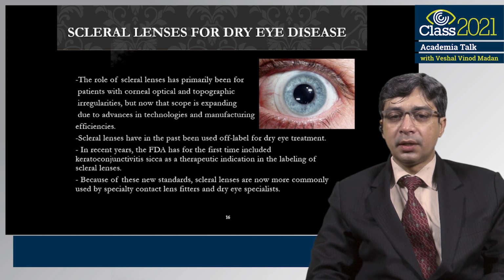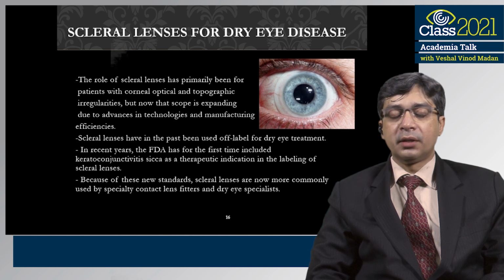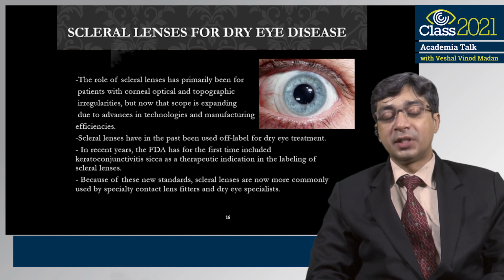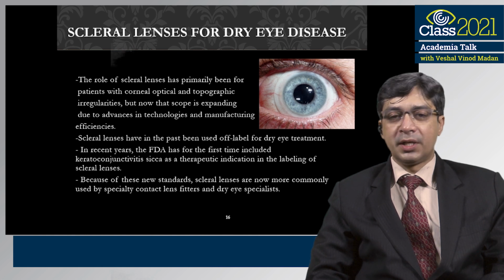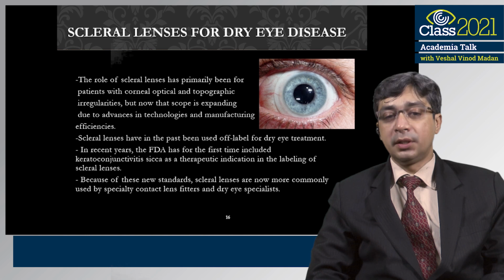Scleral lenses are available in different modalities, and they suit all age groups, whether children, teenagers or adults. They are very much acceptable and easily usable.